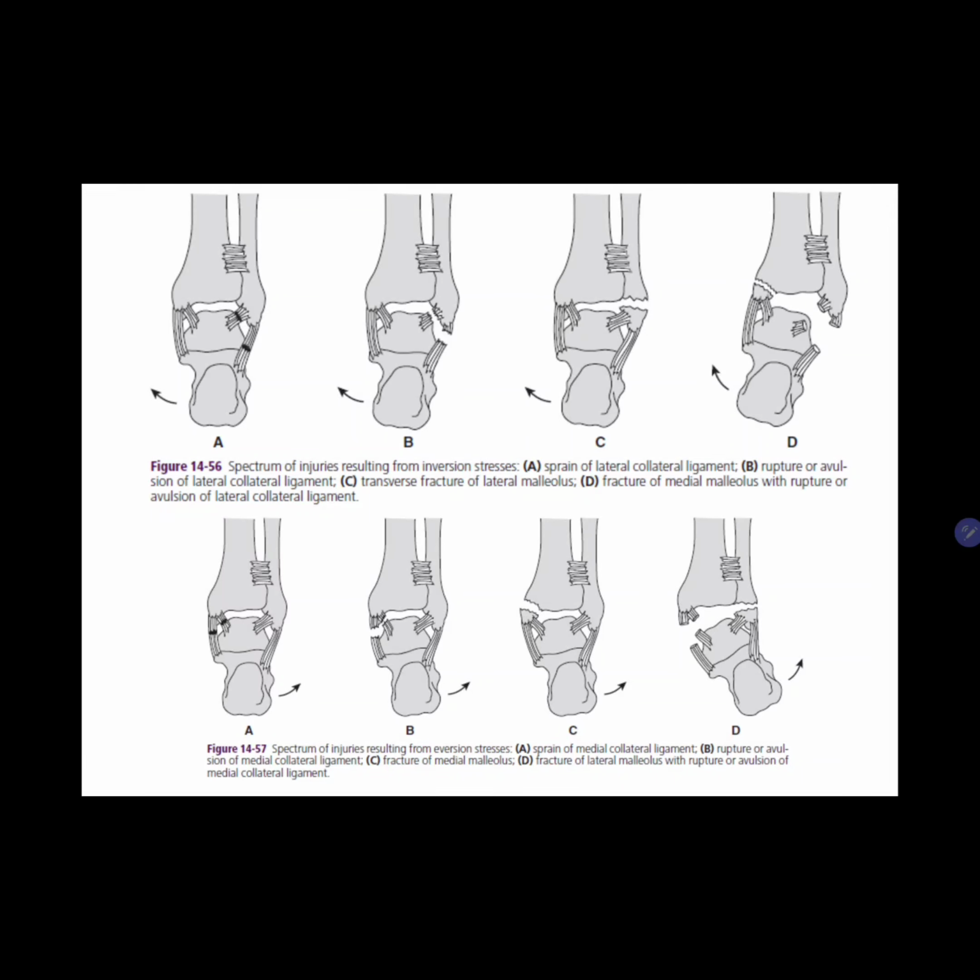So, impingement develops post-injury and is related to persistence of inflammation and synovitis, resulting in scar tissue, hypertrophied soft tissue, and ultimately painful impingement of soft tissue osseous structures during normal joint range of motion. For the imaging evaluation, it is usually needed when an associated fracture is suspected.